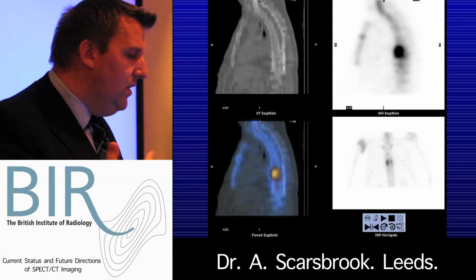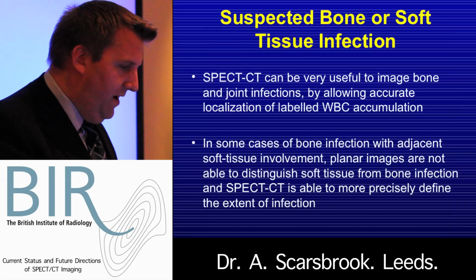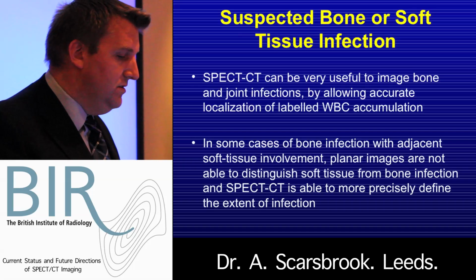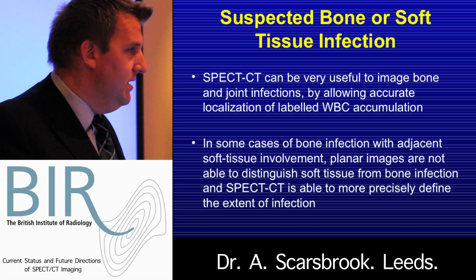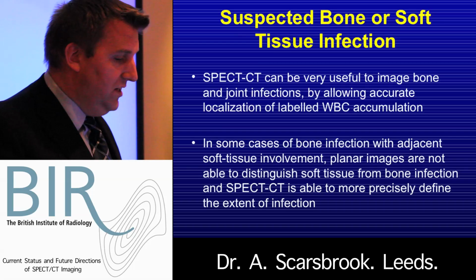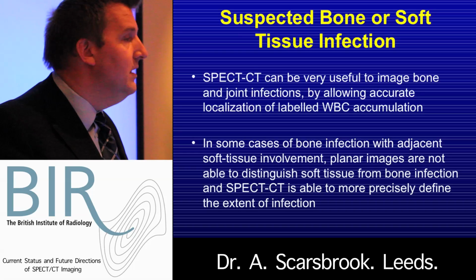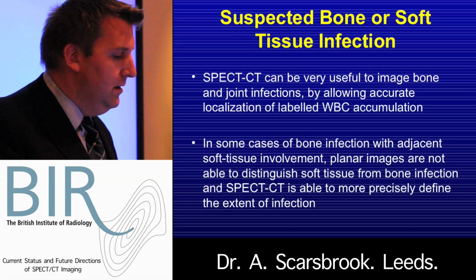Moving on to suspected bone or soft tissue infection, it can be particularly useful because sometimes with these patients, it's critical whether the infection is within the bone or the adjacent soft tissues. And by using SPECT-CT, you can much more accurately define exactly where it is.